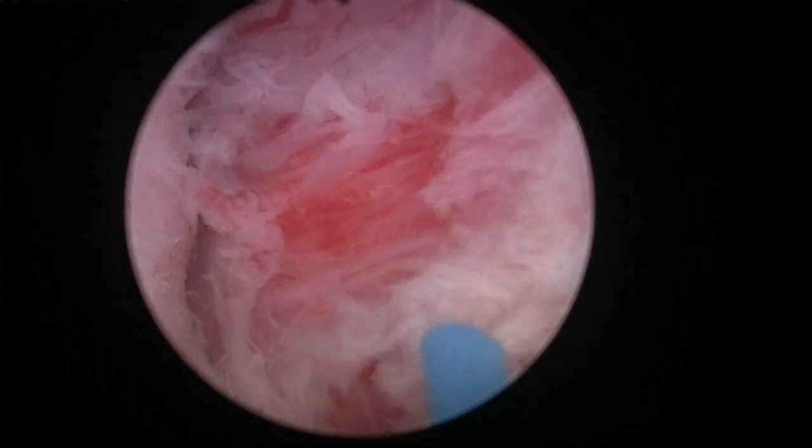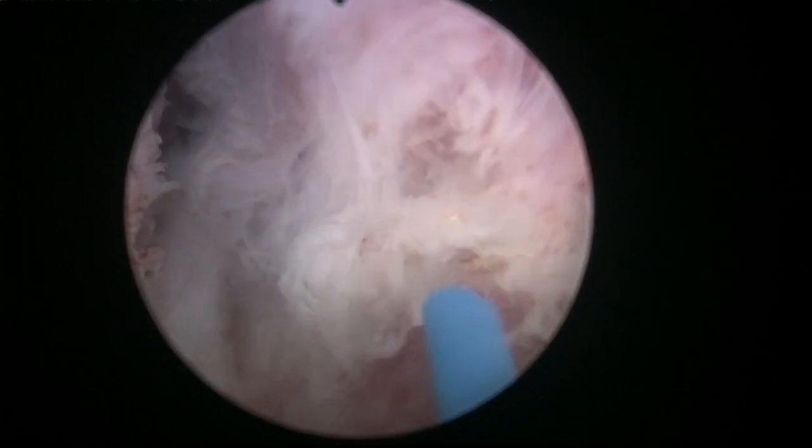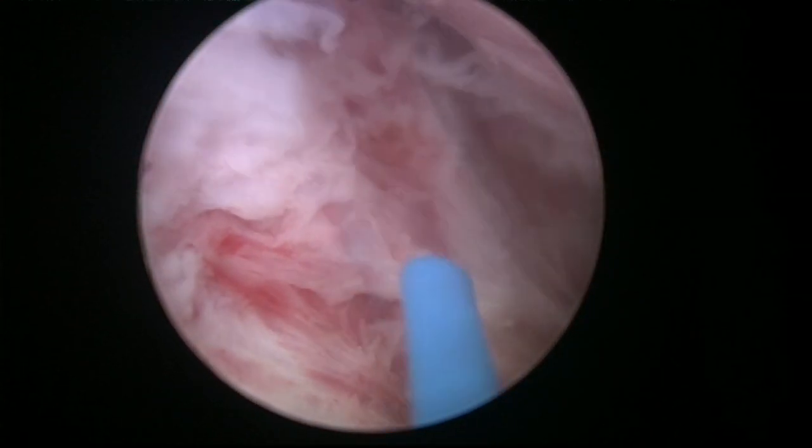You see it's quite capsular. We found a bleeding pumper here somewhere. Maybe I ran out of water, that's the reason as well for the lower visibility. Here it is. So it's very nice to do the hemostasis while the adenoma is still in the fossa, because you see we get much better visibility. And even when we get good hemostasis inside the fossa, when we push the adenoma into the bladder, you'll see that the visibility drops a little bit.